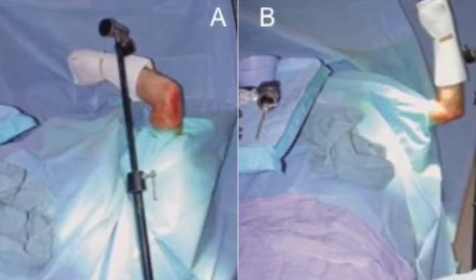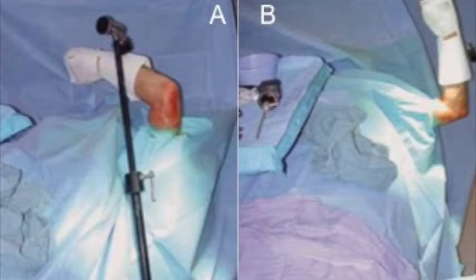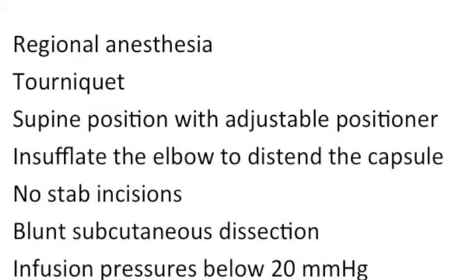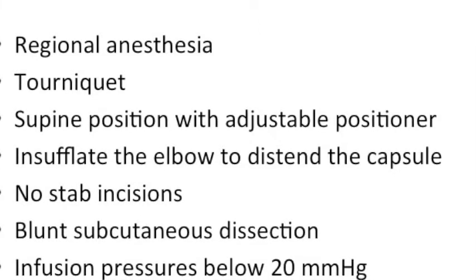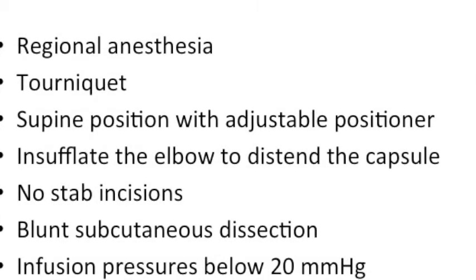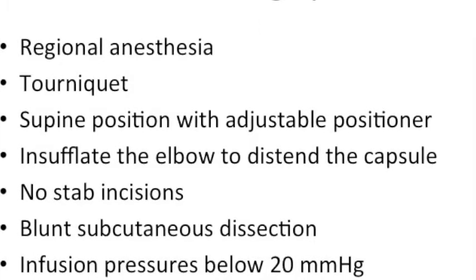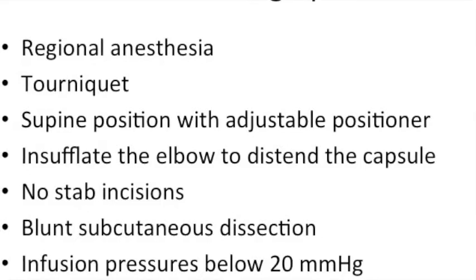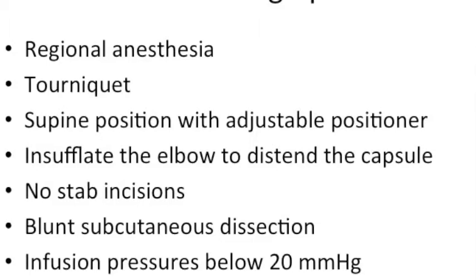The posterior compartment is accessed with the arm across the patient's chest, and the anterior compartment with the shoulder abducted 90 degrees and the humerus parallel to the floor. Critical landmarks, including the ulnar nerve, medial and lateral epicondyles, radial capitellar joint, and the olecranon, are marked. Just as in adult elbow arthroscopy, the pediatric elbow is highly constrained with extensive surrounding neurovascular structures. Unlike the adult elbow, there is even less margin for error. Therefore, the pediatric elbow joint is insufflated with 8 cc's of saline to distend the capsule and displace the critical neurovascular structures away from the joint.